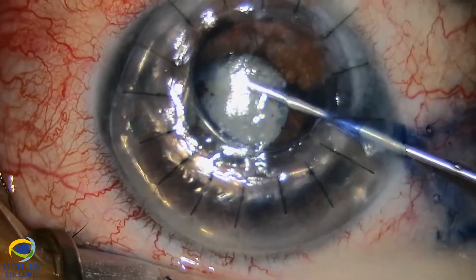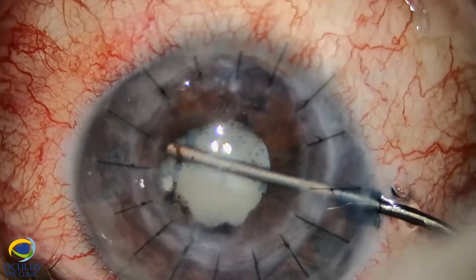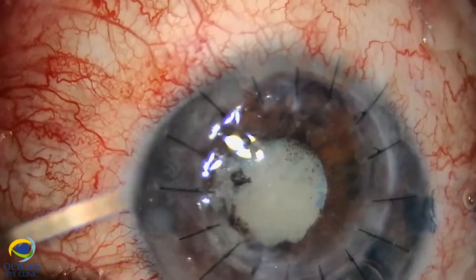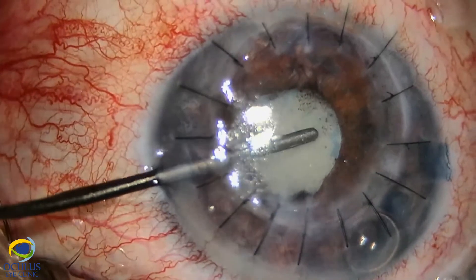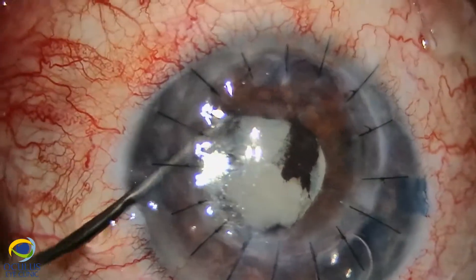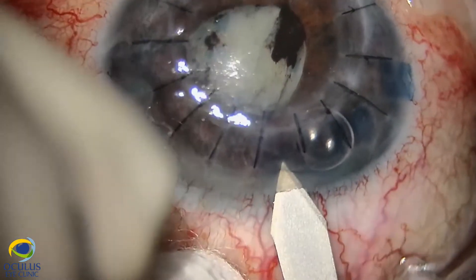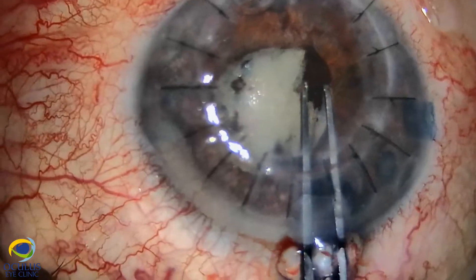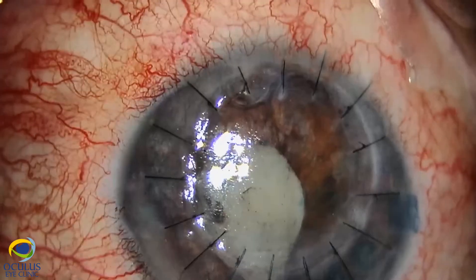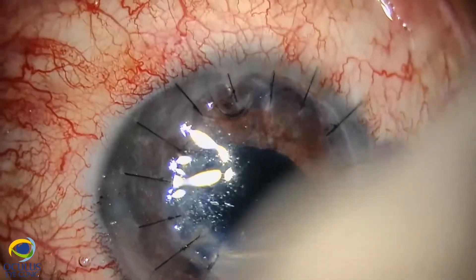We dyed the anterior capsule because of the white cataract. We inserted Viscoat to protect the endothelium and underneath Provisc to preserve a deep anterior chamber — a soft shell technique. With a round spatula we gently detached the synechiae, which were very strong between the iris and the anterior capsule. We entered with a 2.2 mm main incision and removed the fibrotic and pigmentary membrane formed under the iris, especially from the area where the iris had been plugging the perforated cornea.